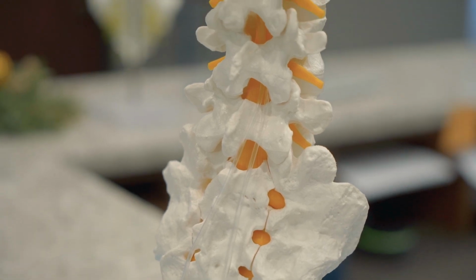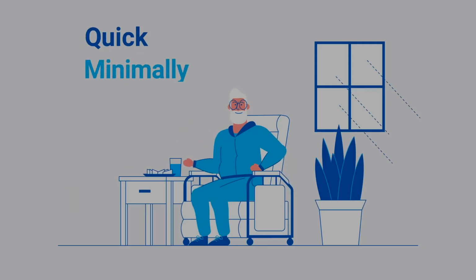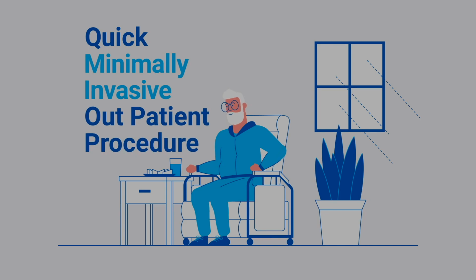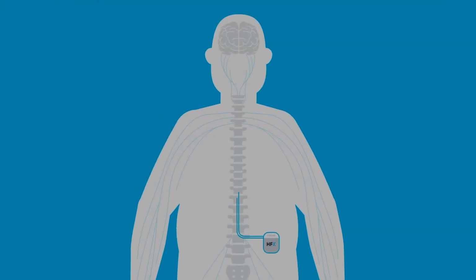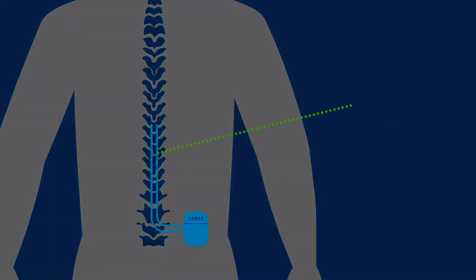At the end of those 10 days, we do an extensive assessment. How much pain relief did you get? If it was successful, then we proceed to the second step. It's a minor surgical procedure where we implant these leads permanently in your spine. Now, this does not involve spine surgery. It's just a minimally invasive, small surgical procedure where we place the leads and anchor them so they won't move, and we place a tiny battery. It is very thin. After a few weeks, after that heals up, you'll forget it's even there.